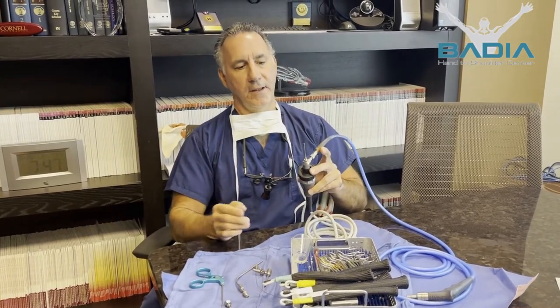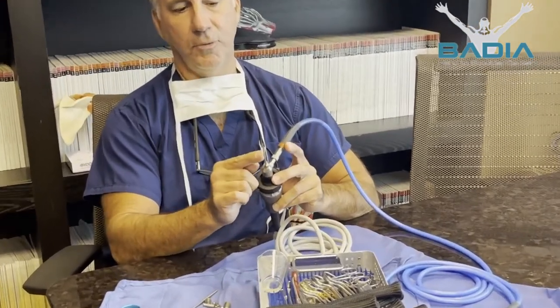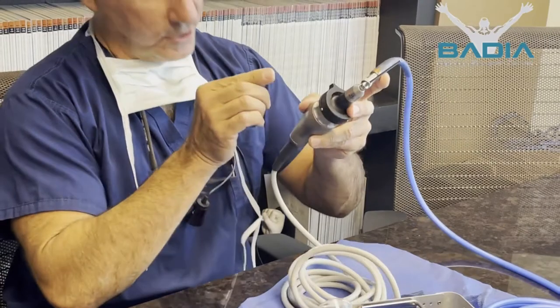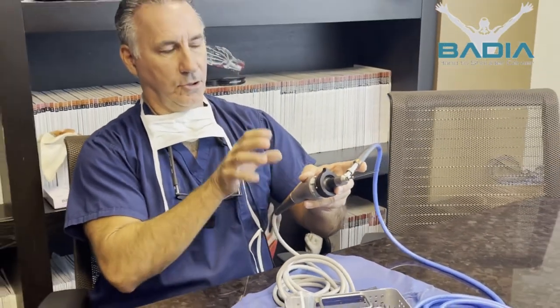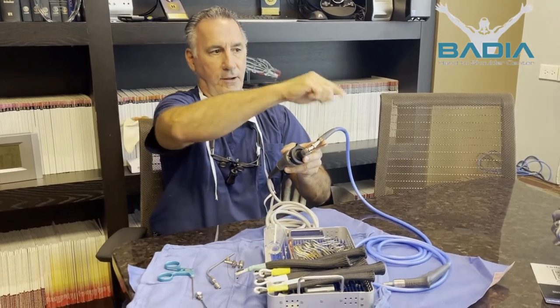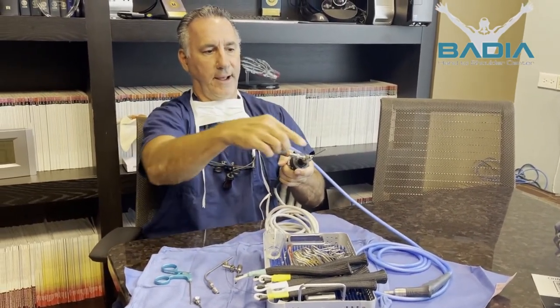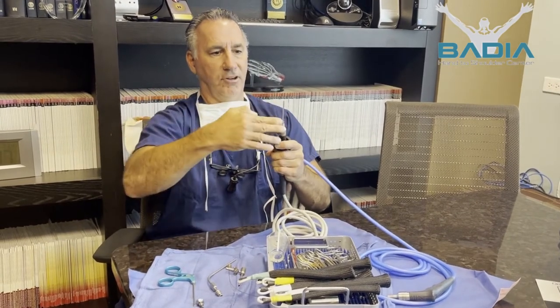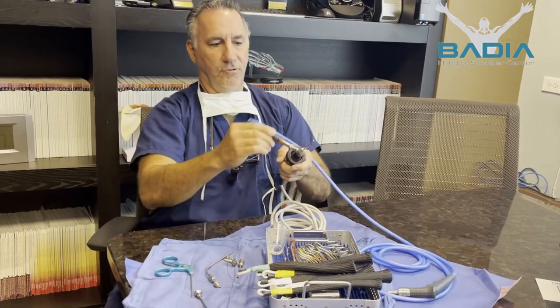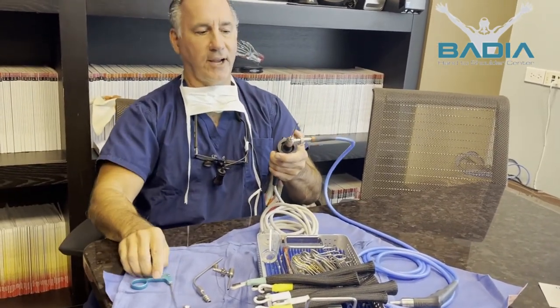This is a small arthroscope — this is what I use for the wrist. This is a 2.7 millimeter, 30 degree, which means that when the camera looks and projects, it's not looking directly but at a 30-degree angle at the end. If I want to look a different direction, I just rotate the light source, and now you can see the inclination of the camera is looking that way.